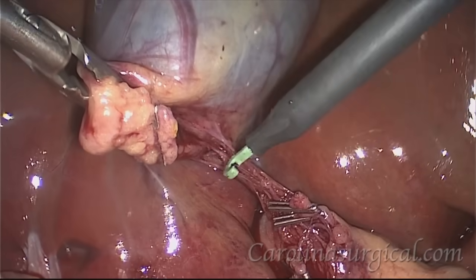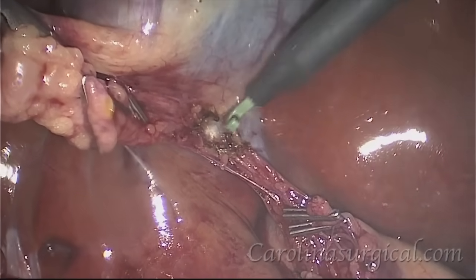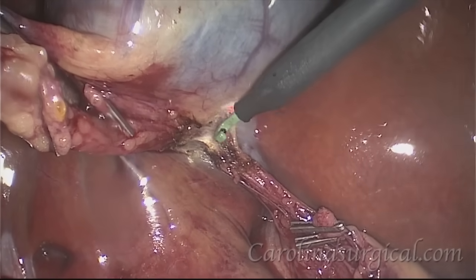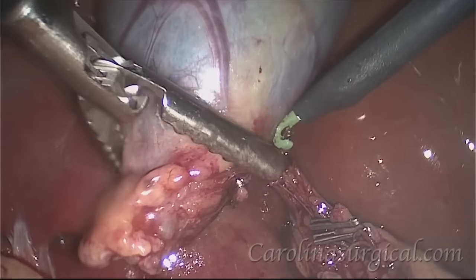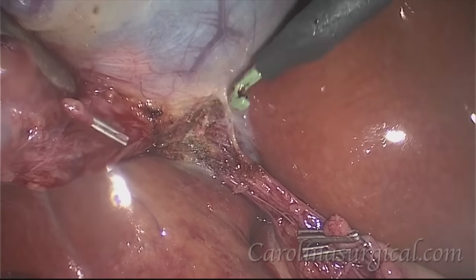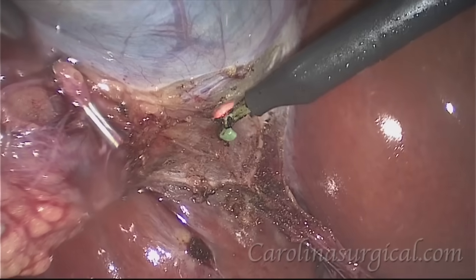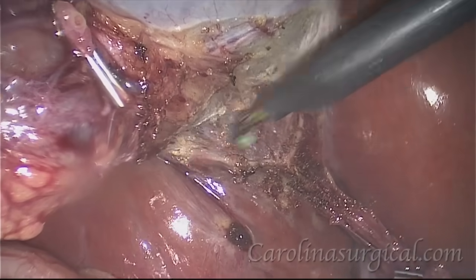Now we're going to use an electric cautery device to dissect the gallbladder off of the liver. You can see this device does create some smoke, but it's nice because it will cauterize any bleeding points as we move along the gallbladder, and we just march our way all the way up the gallbladder, freeing it more and more off the liver.